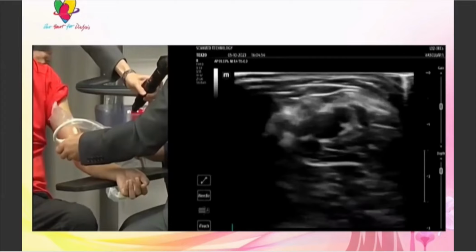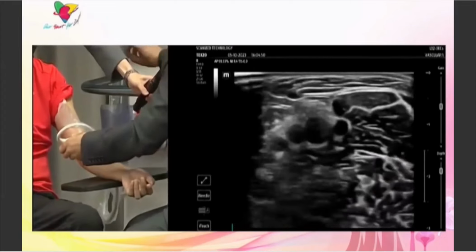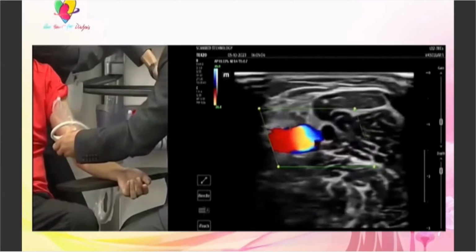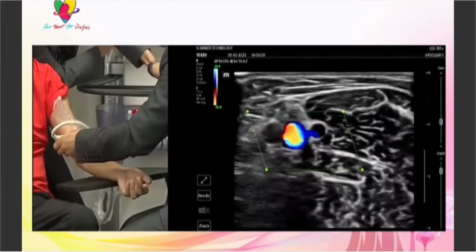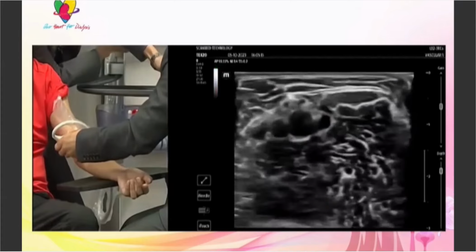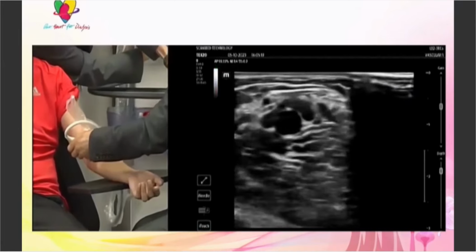So if you see big brachial veins, it means that there's still a lot of flow. Also, you can add the color to see whether there is color flow there. Where's the color flowing through the brachial veins? And as you can see, there is basically no color in the brachial veins, which is a good sign. It means that if the total flow is good, it goes into the superficial venous system. Sometimes a little bit can go into the forearm veins, but usually the valves stop it.